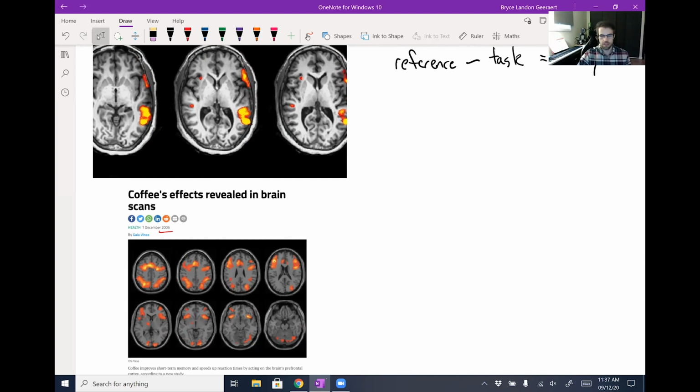But yeah, you may see some wild stories out there, even from 2020. This kind of stuff still happens with fMRI, which is either entertaining or possibly motivating to teach people about how fMRI actually works. Depends on the person, I guess. Any other notes that I had here? Yeah, okay, so we've already talked about how voxels are easily influenced by noise. You need to collect many volumes to make sure that you're actually seeing a meaningful increase in blood flow and signal, and false positives as well.